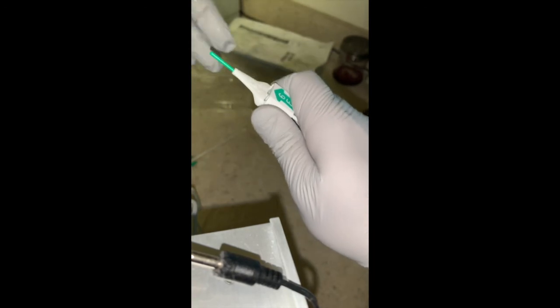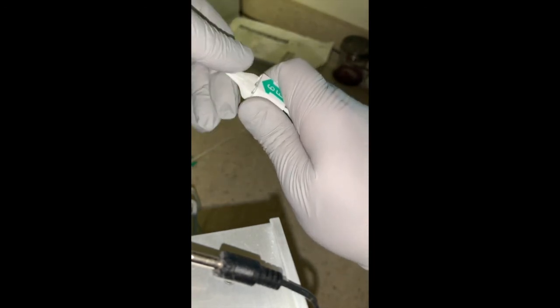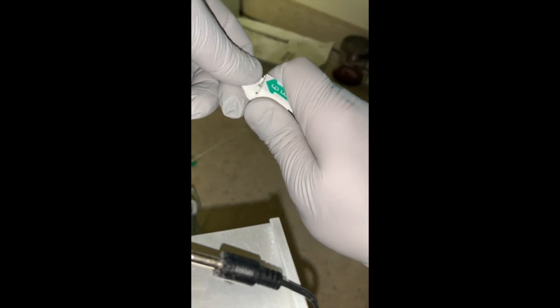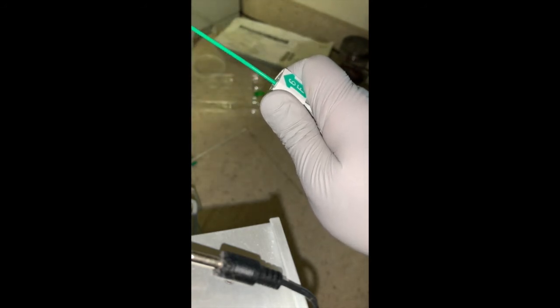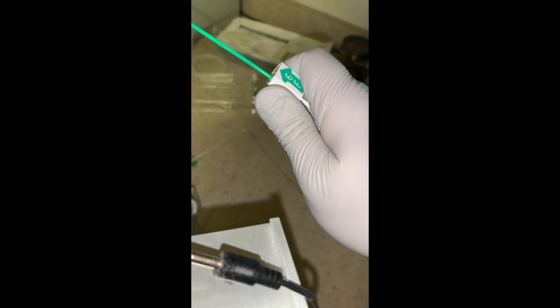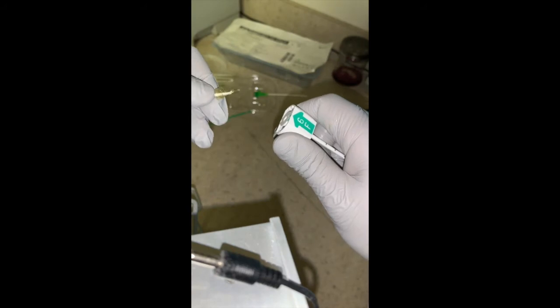Your hand should be rested on the patient's leg — this is not going to move. There is bleeding from the little side port. While holding very firmly, you start to remove the inner portion carefully. Your other hand should not be moving, and you're ready for the next step.